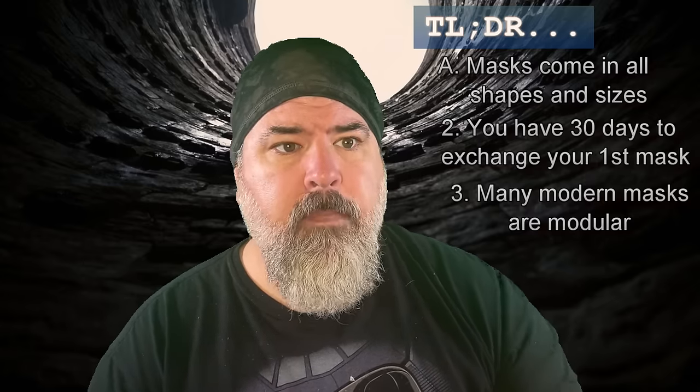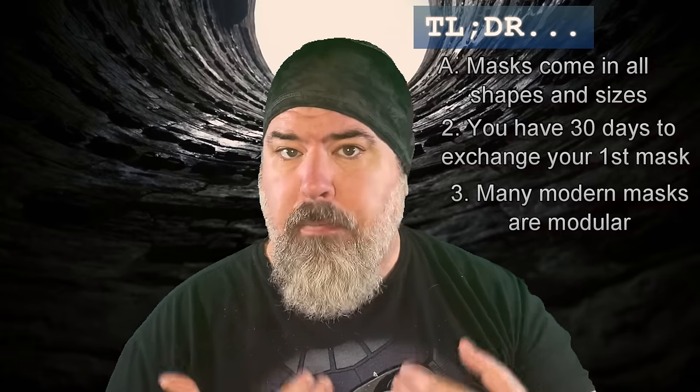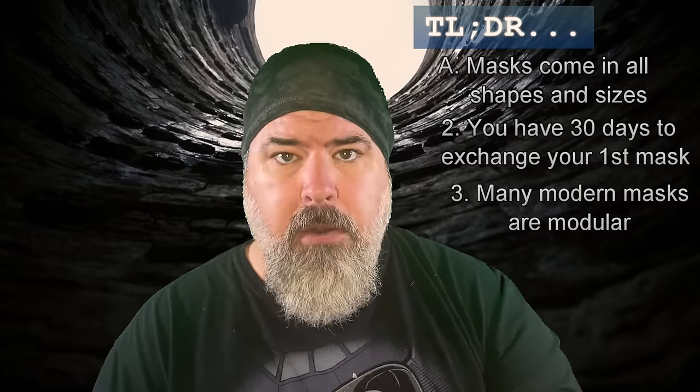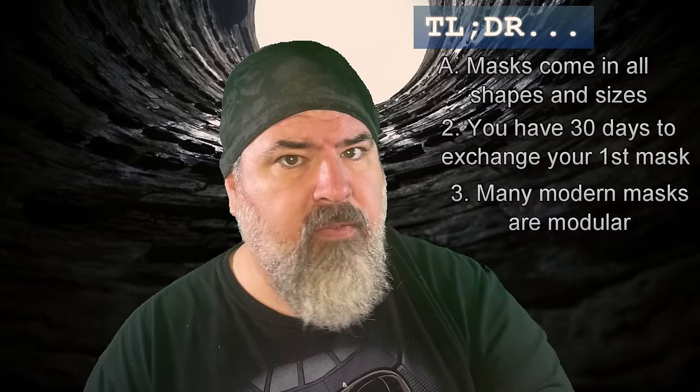Number three, at least if you limit yourself to Philips and ResMed, the masks are modular. So if you have a full face mask and you decide you want to try nasal pillows or a nasal cushion, it's going to cost you, like, let's say $25 to $30 to just change it into a different kind of mask. You have to be careful if you're buying on Amazon, because there are some counterfeit sellers. But if you do your research and read the reviews and find people who say, oh, this seller works for me, I think CPAP Supply USA is the one that I typically use when I'm buying from Amazon. They've always been legit. But yeah, you can swap one of these masks for a different type of mask entirely for not a lot of money.